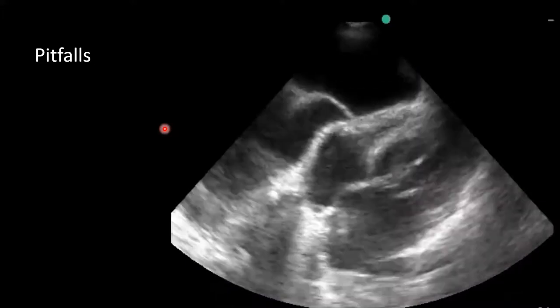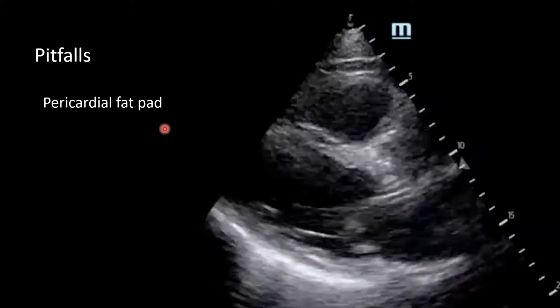Yeah, of course you can. So have you got any reliable methods of ensuring that isn't fluid? Because I get asked a lot of times to be quite definitive about whether I can see any pericardial fluid. And I know a lot of the time there isn't any, but you see that slight sliver and it always makes you doubt yourself slightly.